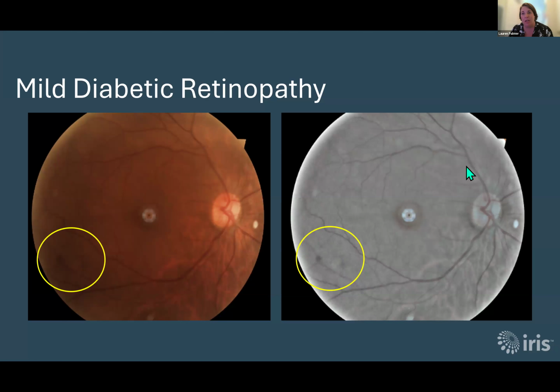Next. Just to summarize what you mentioned earlier, at this point, treatment would likely be focused on controlling the patient's blood sugar. Correct, because there's really no need to treat the eye itself. It purely tells us that whatever we've been doing, if this is new, isn't adequate and the patient needs more appropriate therapy. Awesome. And then we can hopefully arrest the progression. Correct. And even if you get it under good enough control, it actually gets better, as we'll see.